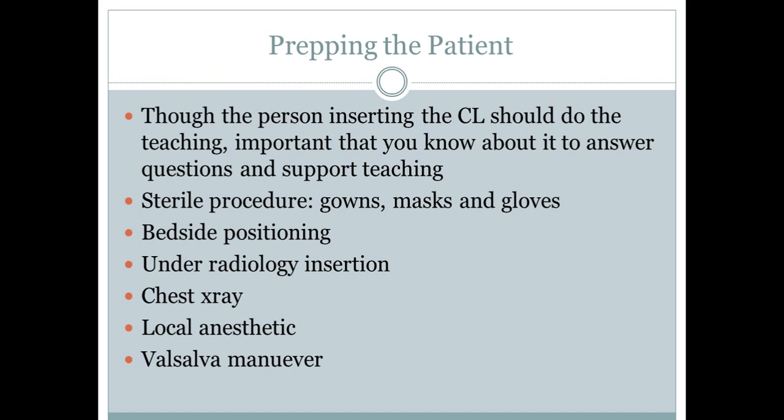They can put in PICC lines at bedside. They could also do it under x-ray as they're doing it, just to make sure that the tip does not extend past the superior vena cava. Same with the midline. They're going to want to see that. If it isn't at bedside, many times they're going to send the patient down to x-ray before they even start administering solutions and fluid to make sure they have the correct placement.